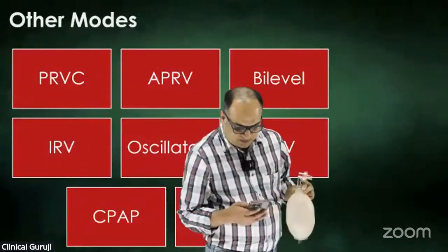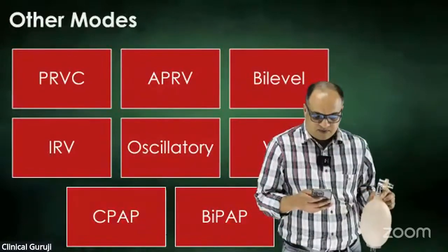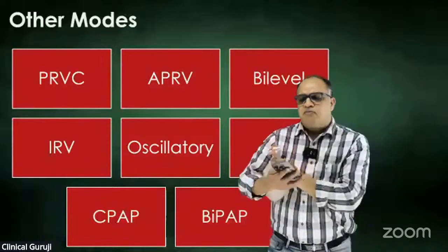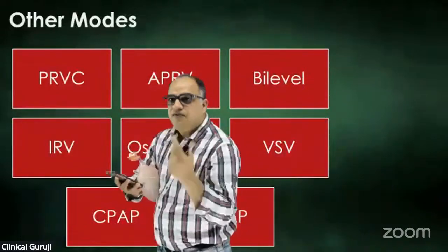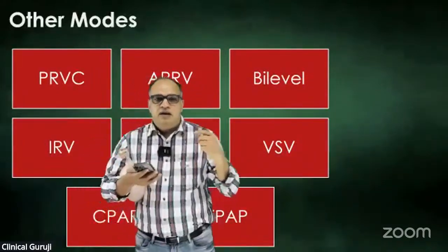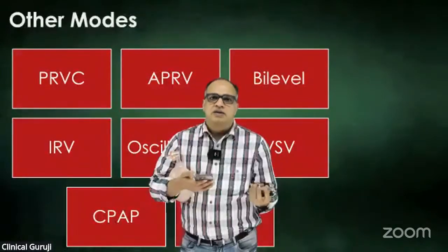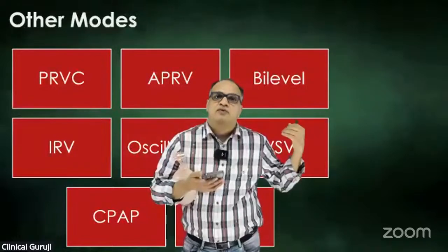Sir, someone has asked, does this mode also have a problem of hyperventilation? Not really, because this is a weaning mode. So if the patient is breathing very comfortably and if he is breathing too much, you can reduce the number of SIMV breaths.